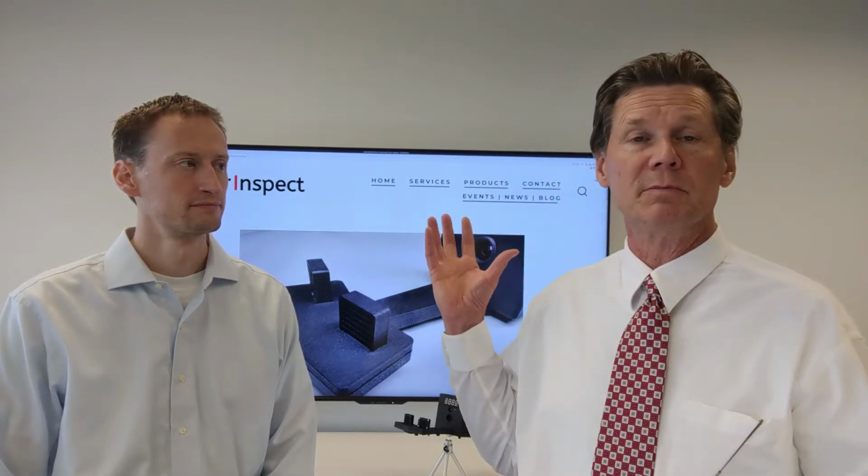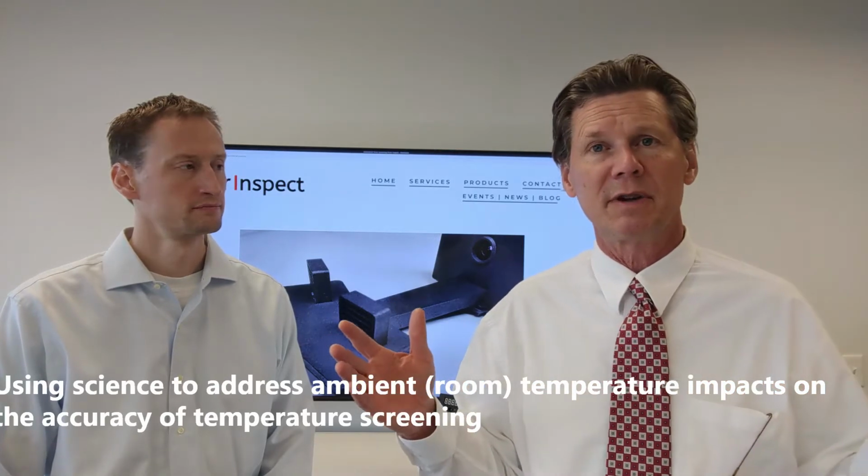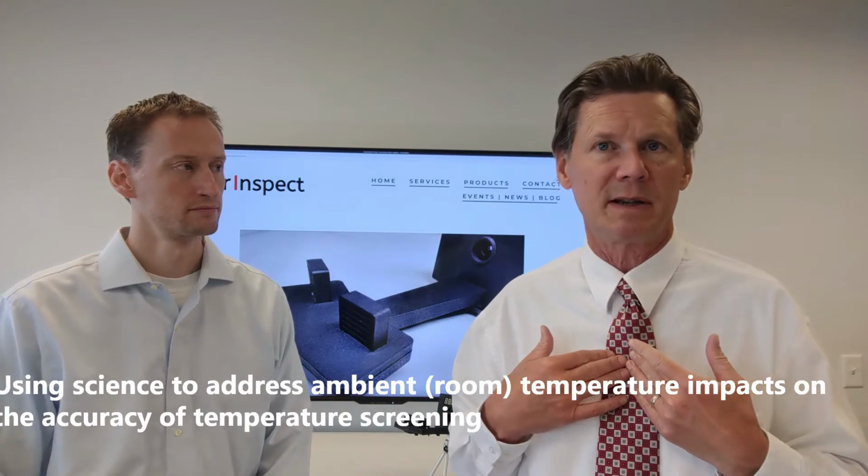And the reason for this video is we want to, again, take a look at real world conditions where we know a key environmental factor, and that is temperature of the room. Air temperature, ambient temperature is going to change, and that has a significant impact, up to 2 degrees Fahrenheit over a 10-degree change in the environment, on the measured core body temperature.